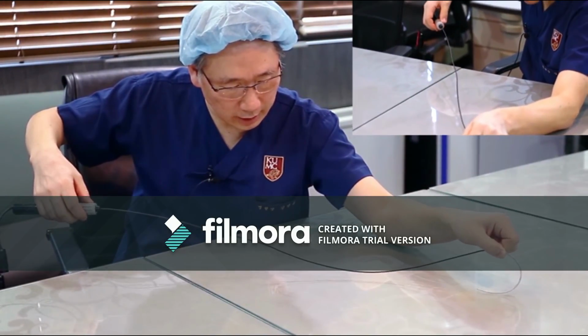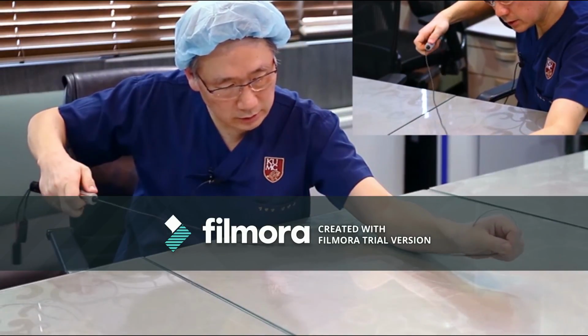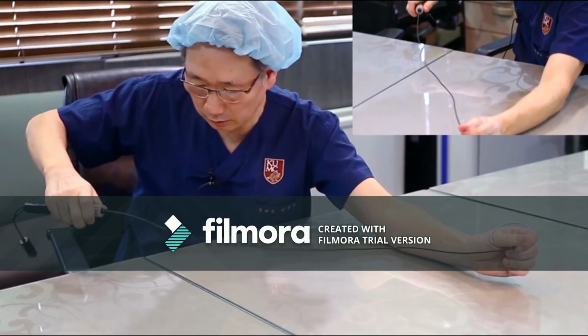And then I change the handheld with a counter-clockwise rotation like this. Okay, once I confirm, I already do the counter-clockwise.